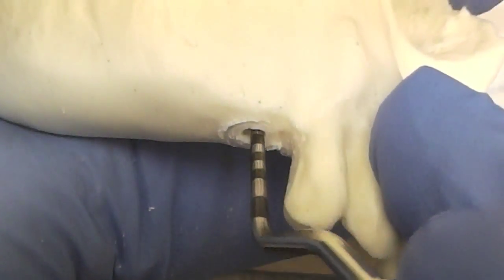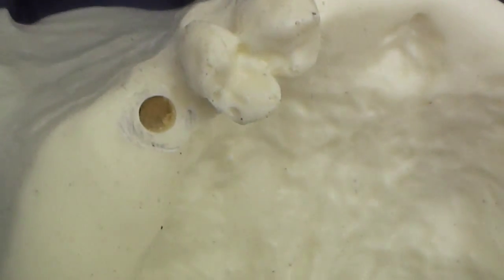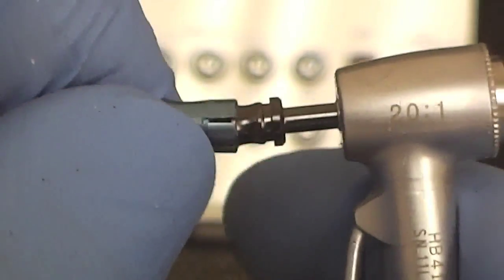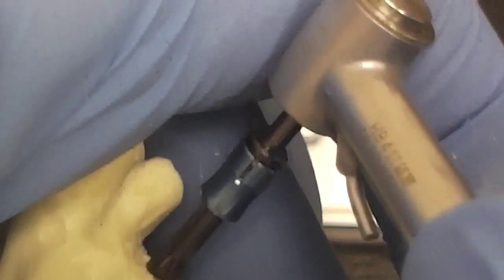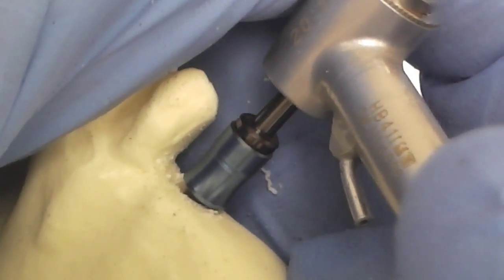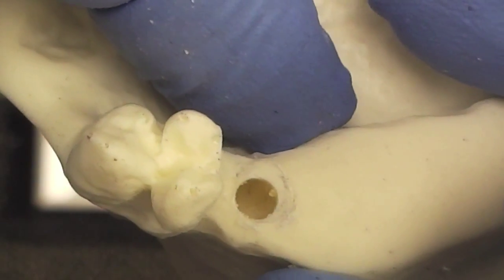Check our membrane, make sure it's okay. I think we have enough buccal and lingual thickness to go ahead and increase the size of the osteotomy to 3.6 millimeters, which is the final available size. Handpiece. Place the stop on the safe-sided reamer and go forward with our next osteotomy. Again, the safe-sided drill keeps us okay, and there's our final osteotomy, and now we're ready to go ahead and do our bone graft.